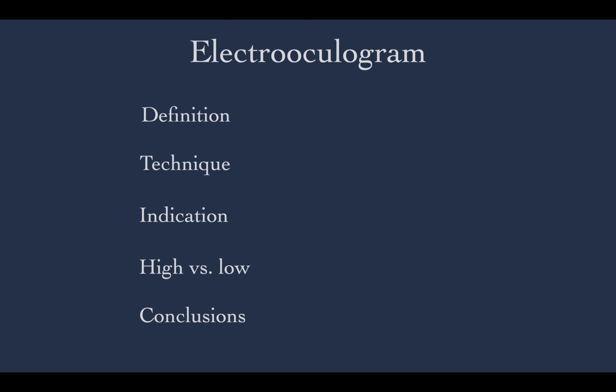Some of the main indications of EOG are Best disease, adult vitelliform disease, any conditions that affect the retinal pigment epithelium, pattern dystrophy, fundus flavimaculatus, and retinal trauma.